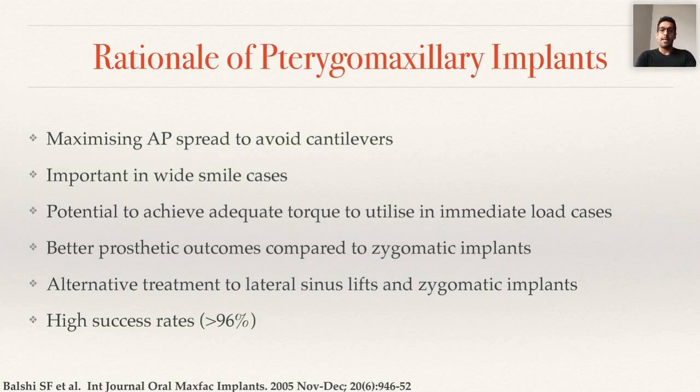If we have a distal cantilever, we are potentially doubling the load on the distal implant, and we really want to try to avoid that. It's important in wide smile cases. When some patients have a really wide smile, they potentially show up towards the first molar and sometimes up towards the second molar. And when we're restoring these patients, they may not want to see a gap that far back.